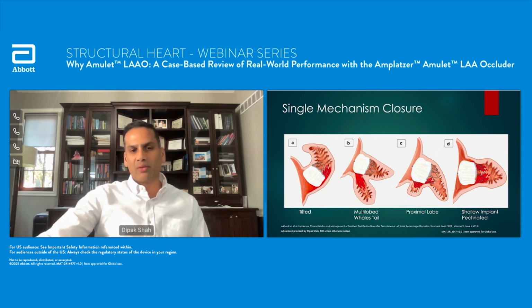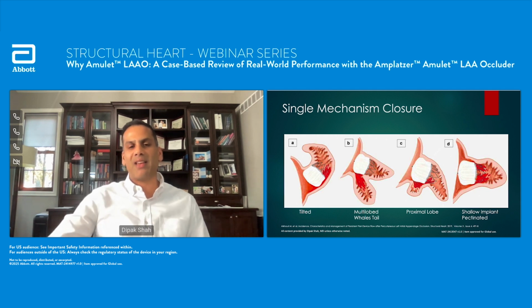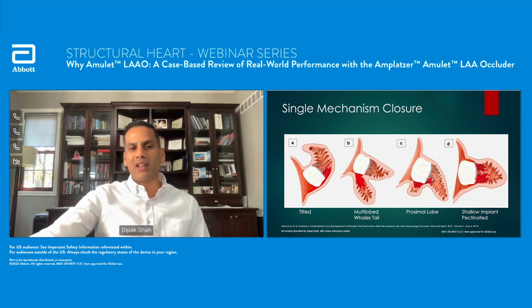With these whale's tailed appendages, when you have a bifurcating appendage, you have to self-select. You pick which lobe you're going to put the Watchman in, and then your goal is to oversize and expand it out. The problem with that is you get a huge shoulder, and sometimes it gets sucked in, and then you're left with a significant leak.